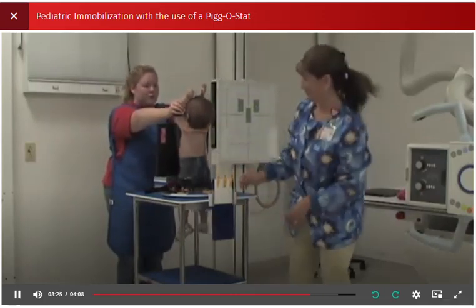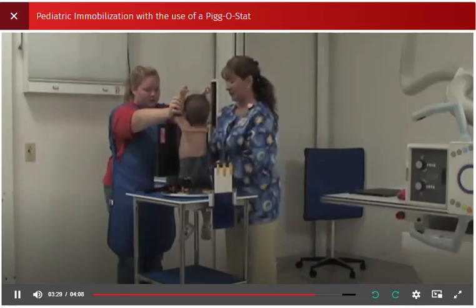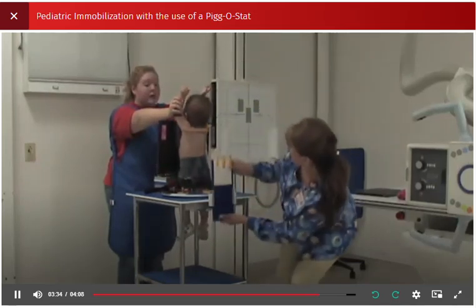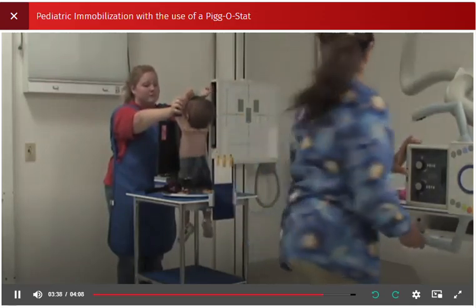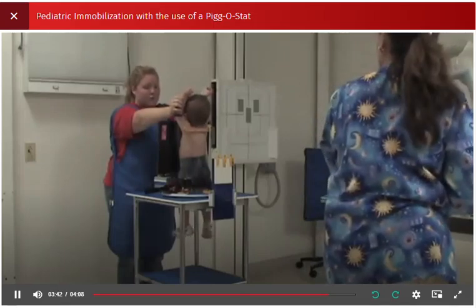At this time, the technologist will make sure that the patient is in true PA, adjust the image receptor, the light collimation, and gonadal shielding on the child. The technologist is now ready for the first exposure. The radiographer must be prepared to initiate the exposure on full inspiration.